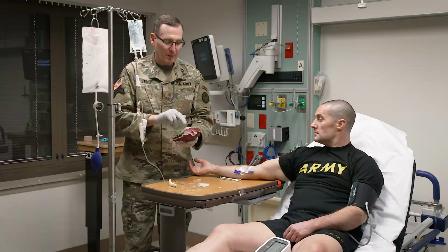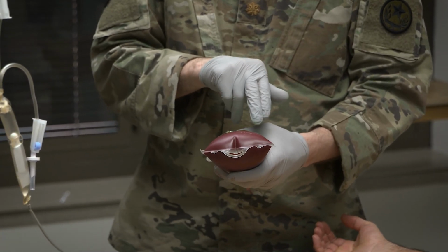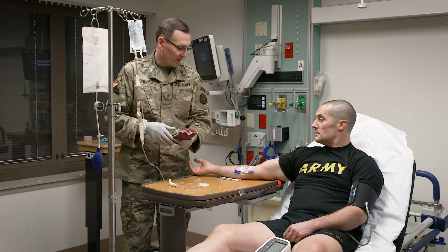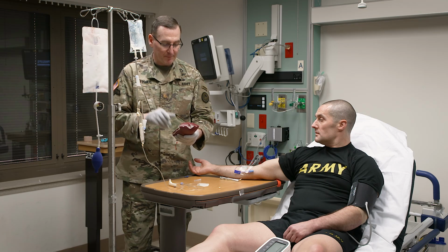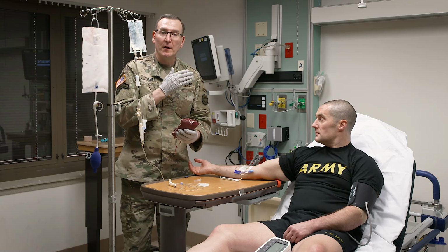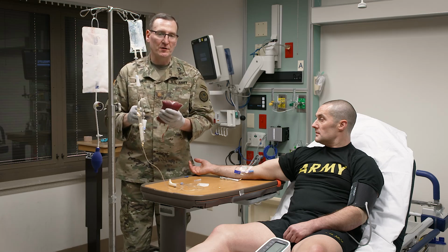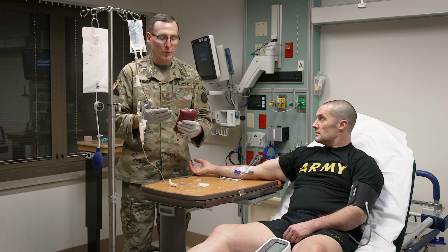So I know that based upon my blood bag label, especially if I collected it, I drew it from this battle roster number, and this is the ABO type. And I know this also because I have the Eldon card if I need to check that. Now, if I don't have a roster, I'm going to go ahead and do an ABO on my patient also. So make sure you're doing donor and patient for an ABO if you do not have a pre-made list that has been generated for you.